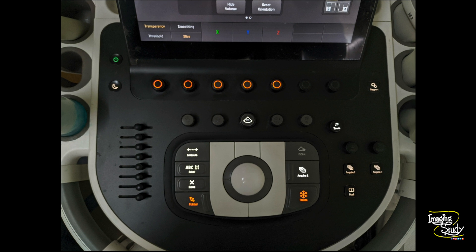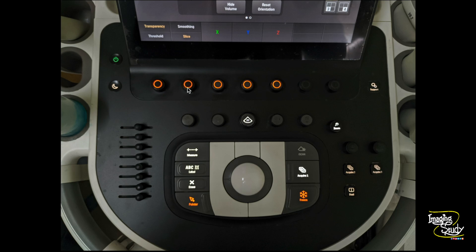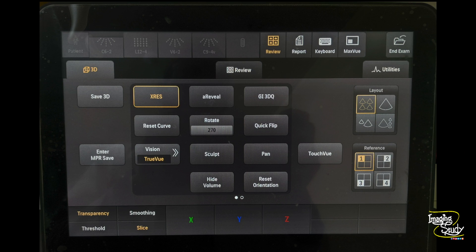Now let's look at the machine keyboard first. There are several options here like the regular freezing options, measurement options, or mode options. You'll see a 3D button here — we'll use that. On the lower part of the screen there are several options like transparency, smoothing, threshold, and slice, which are controlled by these buttons.